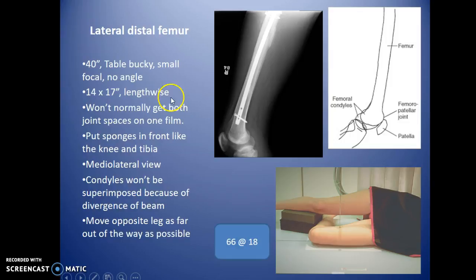For the lateral distal femur, use a long cassette lengthwise. You can put sponges in front like the knee and tibia — we want the cassette in the front, then cross the leg over as much as possible. This is a mediolateral view, meaning the beam goes through the midline and exits the lateral portion. The condyles won't be superimposed because of beam divergence, so the ends should be somewhat lined up to correct for rotation, but the inferior lines typically will not line up.